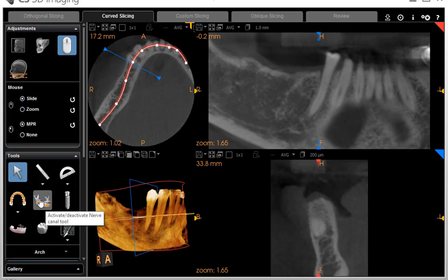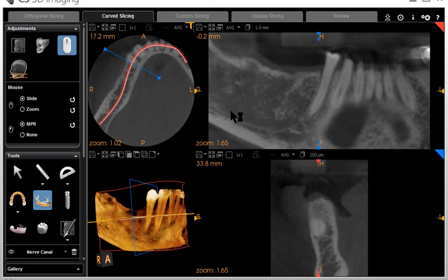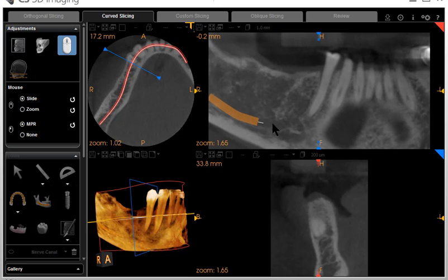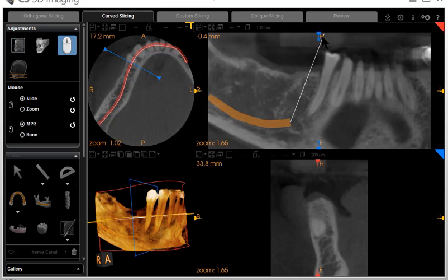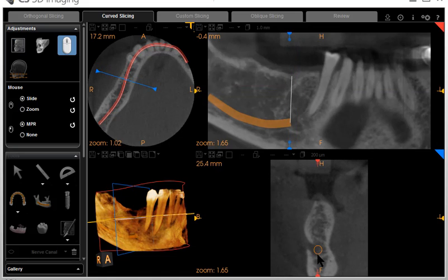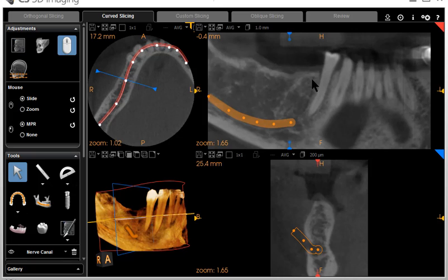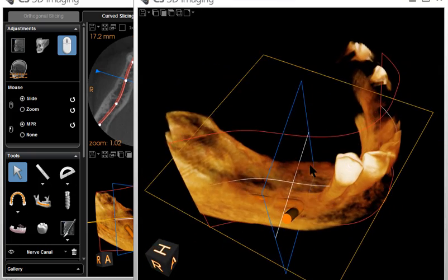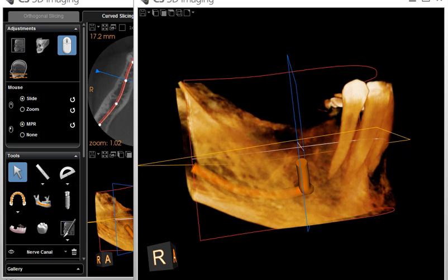This icon activates the nerve canal tool. This just traces the nerve and makes it a little more visible. If we do that and then rotate the mouse button, we left-click where we want the nerve canal to be. You can move to a different view to illustrate where the mental nerve comes out. When you get to the end, you simply double left-click. Now you can see in the 3D view how the nerve is embedded in the bone, and when you rotate the slices, you can see where the nerve is.